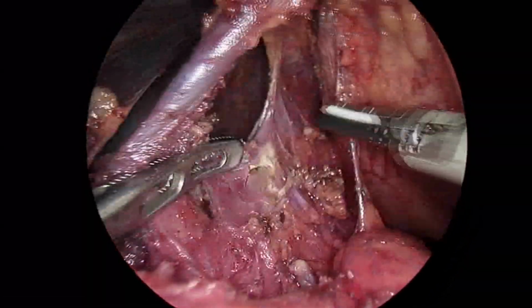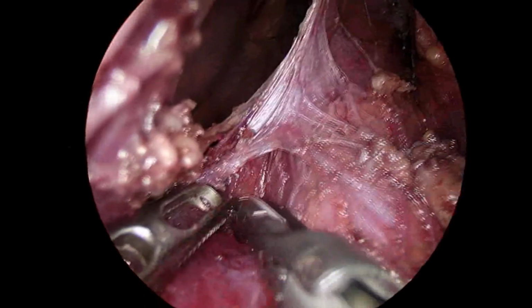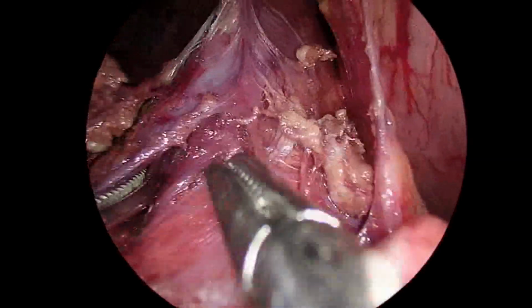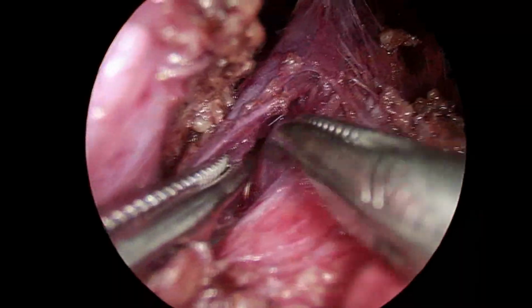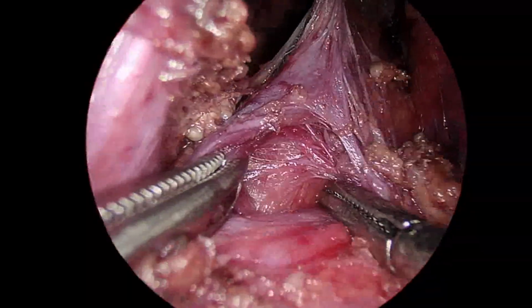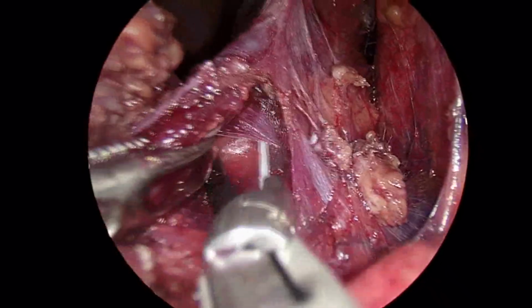So that's the left gastric vessel. These are the crural fibers which were on the aorta. We also gave ICG to this patient on table for delineation of the anatomical structures. So we are splitting the diaphragmatic crural fibers and identifying the aorta.